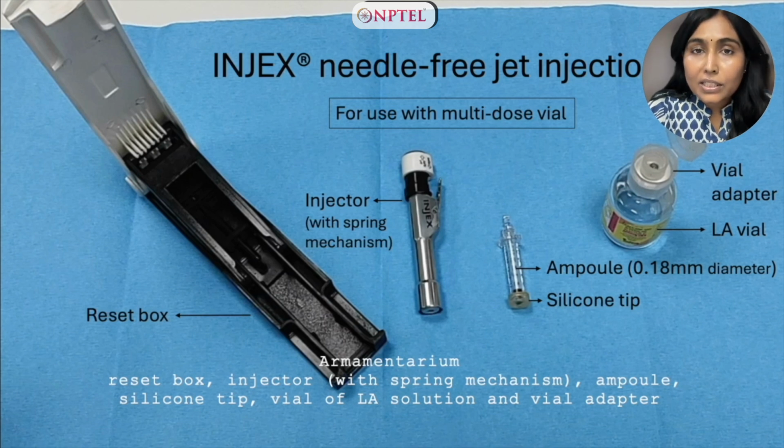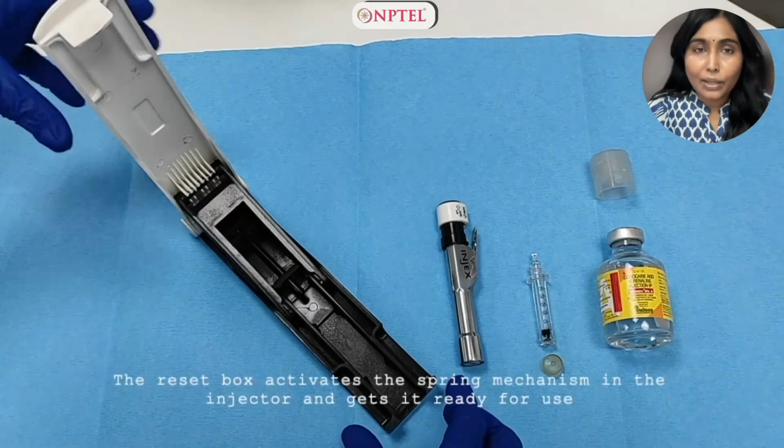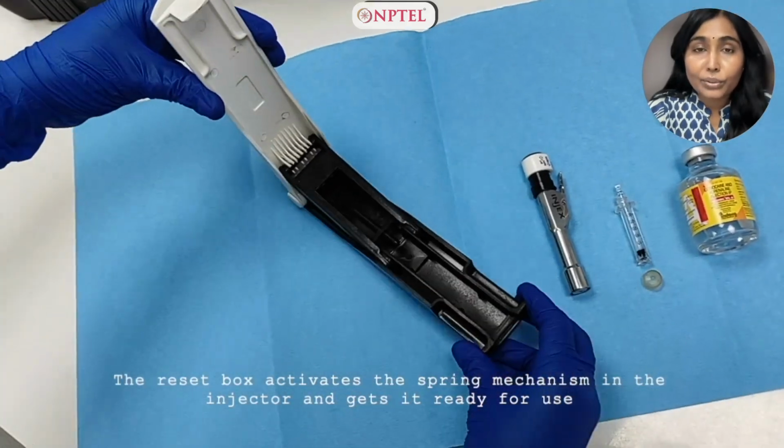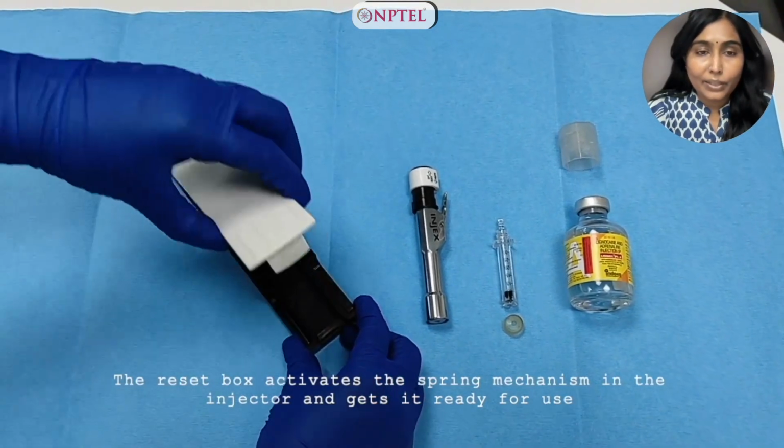A nozzle of such a small diameter is needed to create a jet of local anesthetic solution. The ampule is disposable, while the silicone tip is autoclavable. For use with cartridge, you need a transporter. The transporter is used to place the cartridge from where local anesthetic solution will be loaded into the ampule. But my demonstration of the system now will not use a transporter because I'm not going to use a cartridge. Instead, I would be using a multi-dose vial of lignocaine.